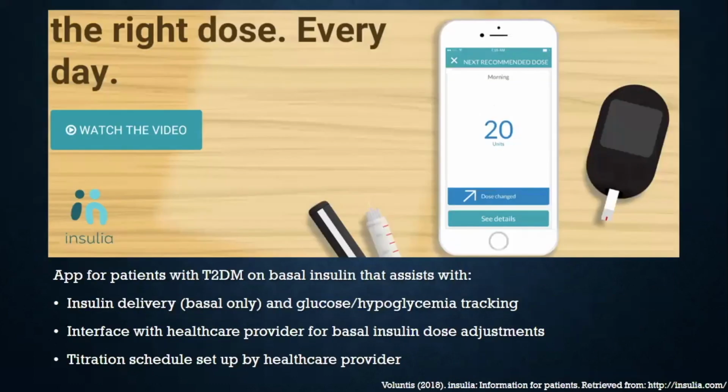The Insulia app is really more for patients with type 2 diabetes who are just on basal insulin. And it really is sort of an agreement and work with a healthcare provider to titrate basal insulin doses and minimize hypoglycemia. There's an interface with the patient's healthcare provider, and they provide an algorithm to titrate basal insulin doses based on what the fasting blood sugars are throughout the week.